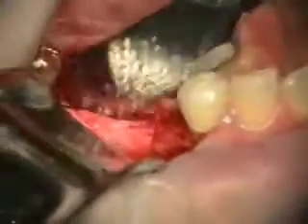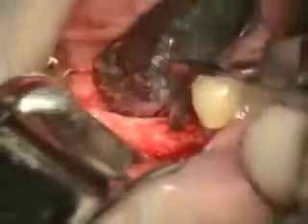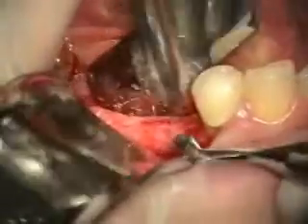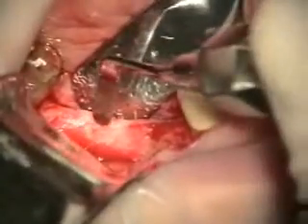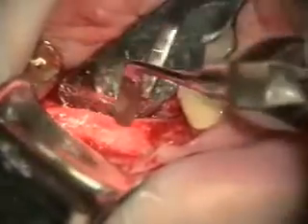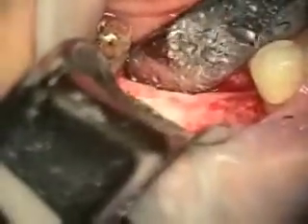We've got our flap reflected here and you can see where the extraction was right here. She's got really good healing of the bone graft. We're putting a 3.5 here and a 4.5 in this area, but you can see she's got this kind of a ridge of bone here, so I'm going to be flattening that off a little bit. We've taken that down and flattened that with just a high speed.